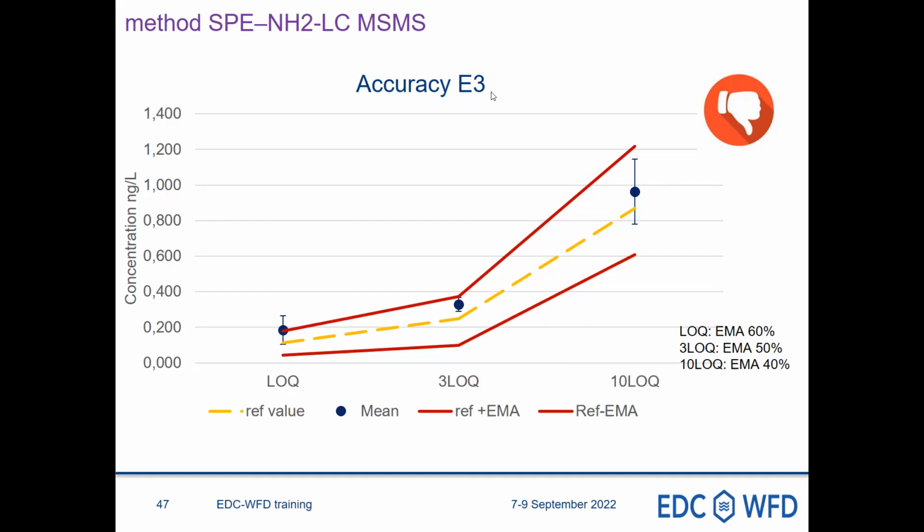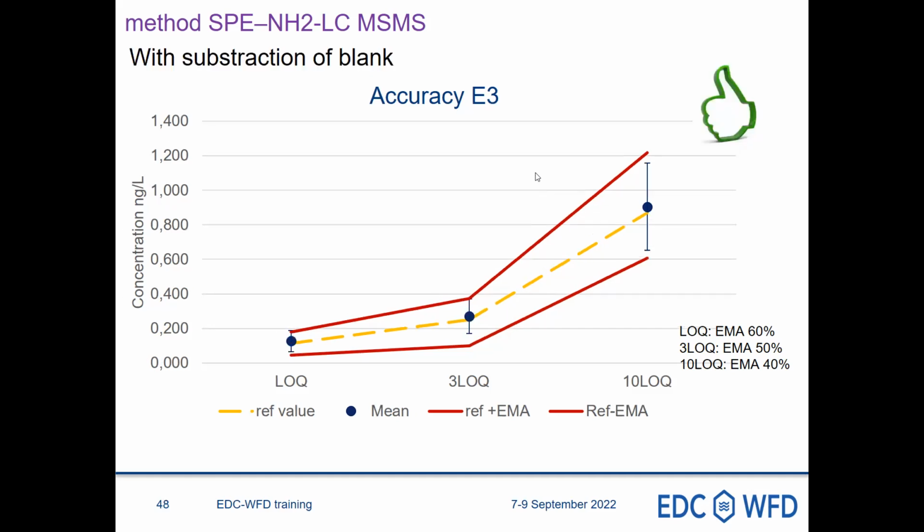And for estriol, we do not have EQS. It is not mandatory, so the level of concentration should be set at convenience. So this is the reason why we overpass this, and we could assume that this method is fit for purpose for WFD monitoring. Once more, we would like to show you and demonstrate.